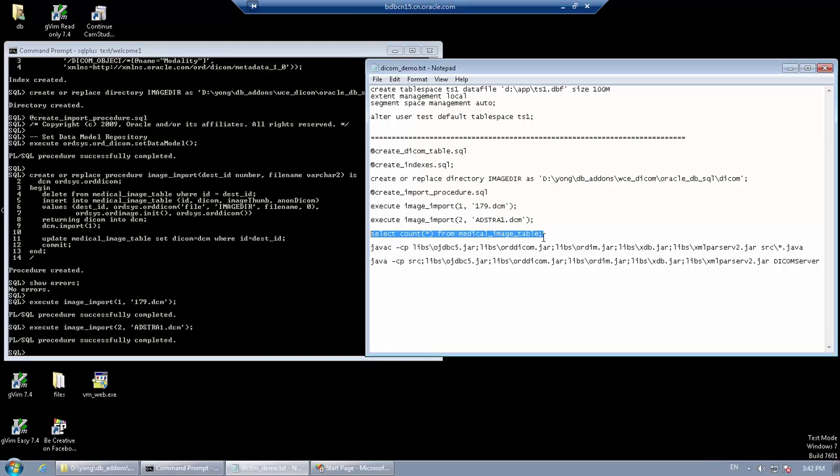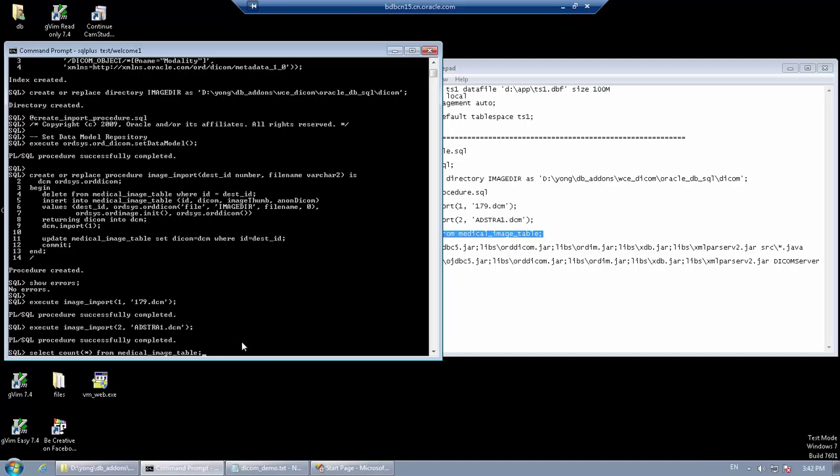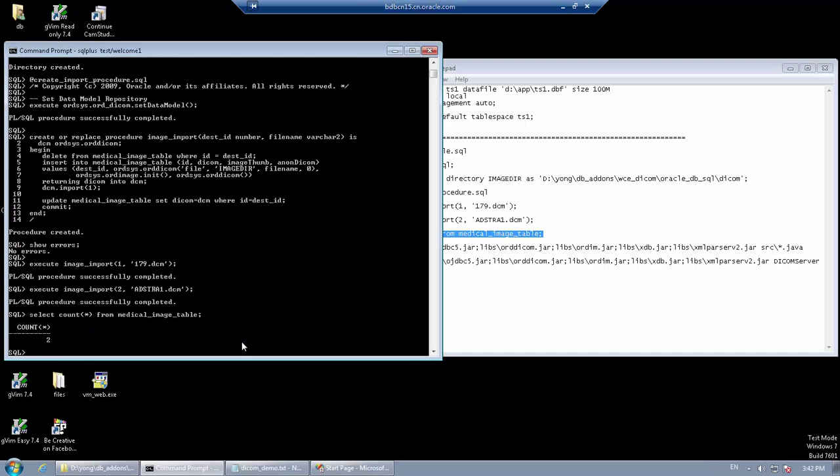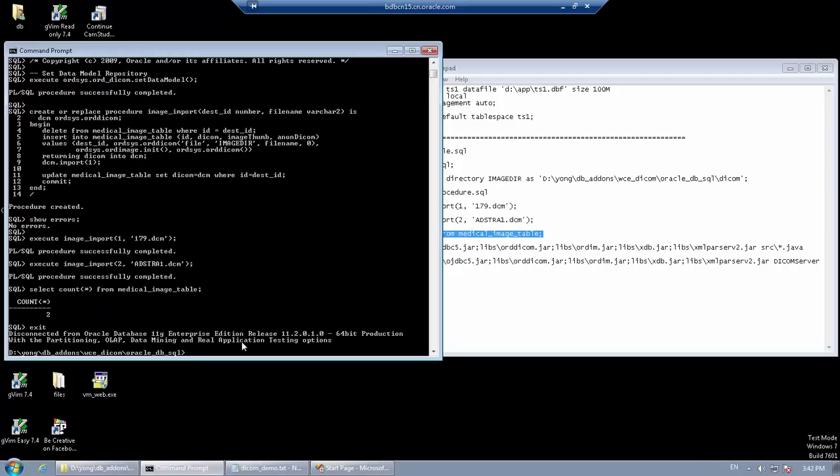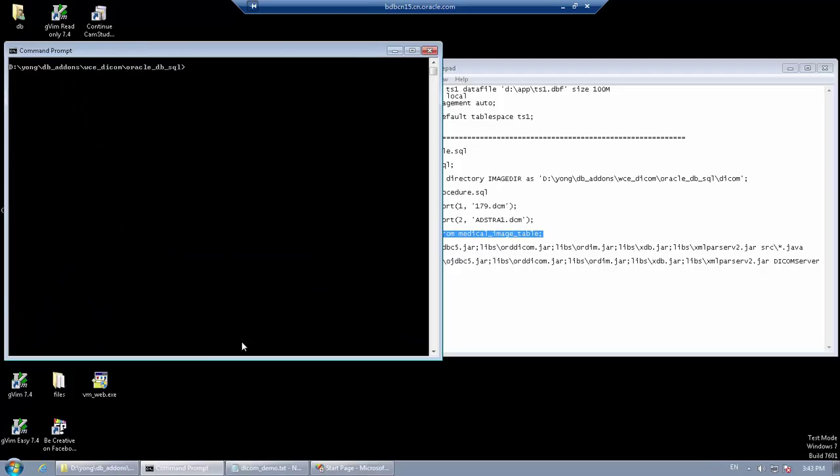Now we can check that our sample database contains two DICOM files. Now we have created our sample database. Now let's turn to the application server.